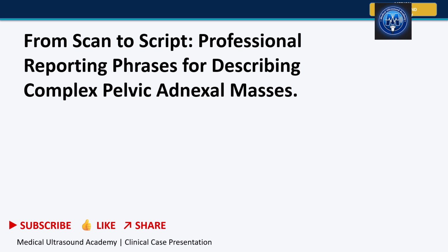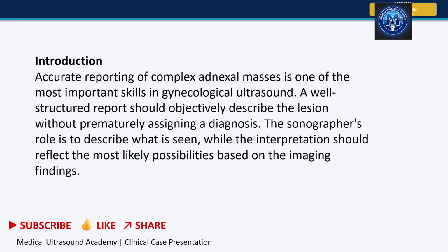From scan to script: professional reporting phrases for describing complex adnexal masses. So, the introduction. Accurate reporting of a complex adnexal mass is one of the most important skills in gynecological ultrasound. A well-structured report should objectively describe the lesion without prematurely assigning a diagnosis. The sonographer's role is to describe what is seen, while the interpretation should reflect the most likely possibilities based on the imaging findings.